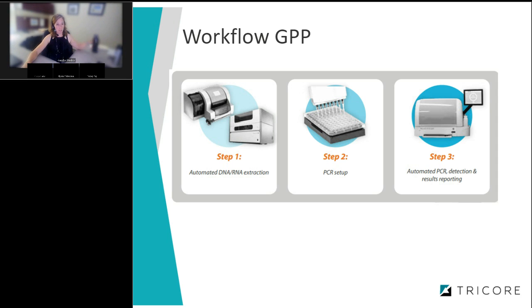So the workflow for the GI panel is an automated DNA or RNA extraction, followed by PCR setup, and then automated PCR detection and results reporting.